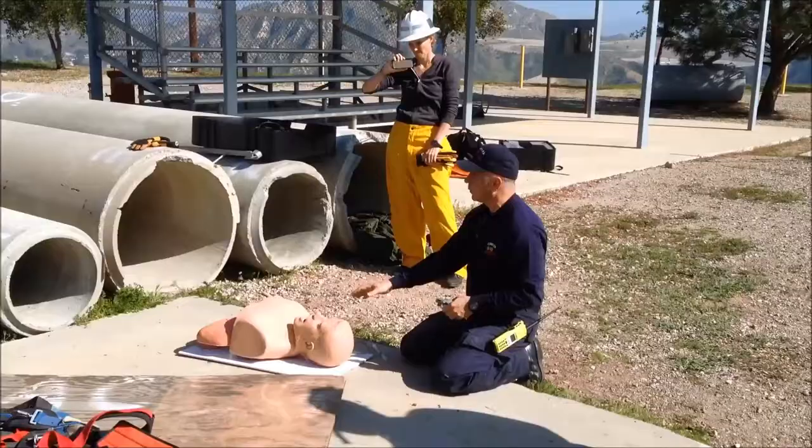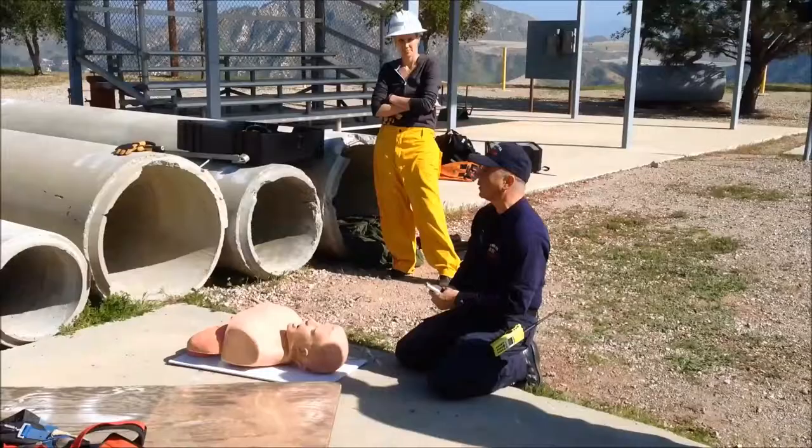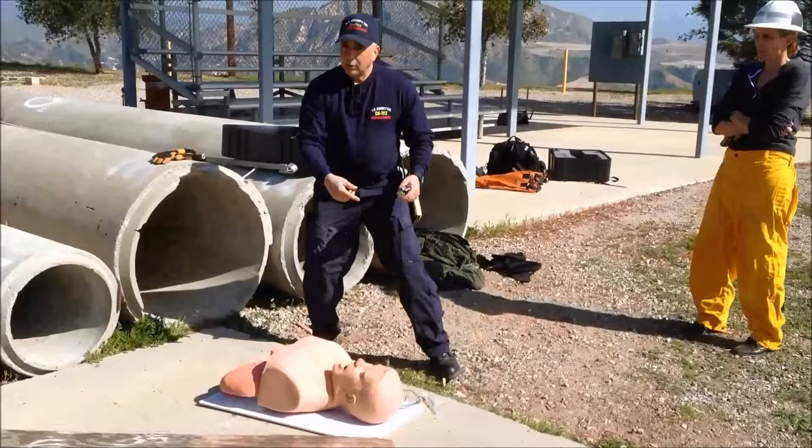When you get to the patient, you have to put your head above the patient's head and there might not be enough space. Sometimes you get there, you take your helmet off, you intubate, put your helmet back on for the extra person. So one way to buy yourself a little more space — that's if you meet the patient this way.